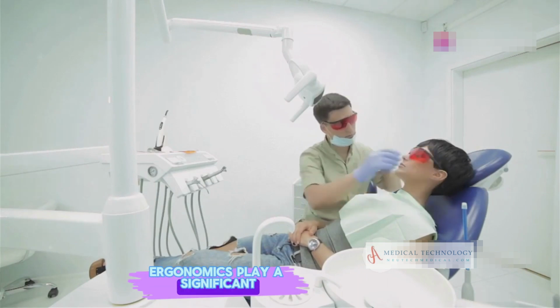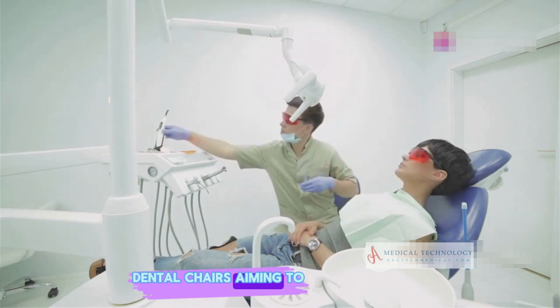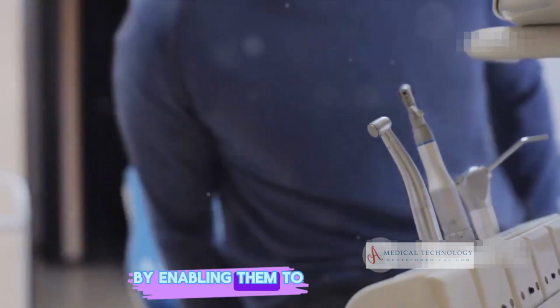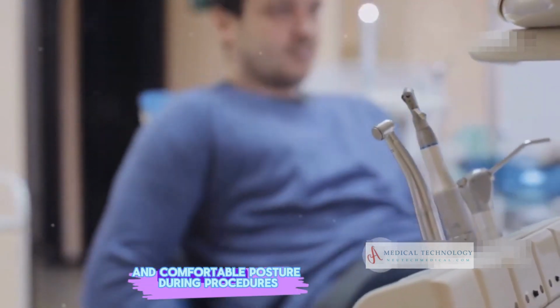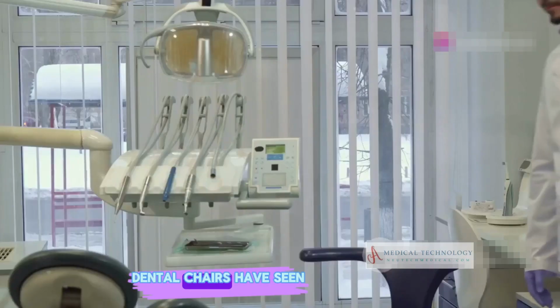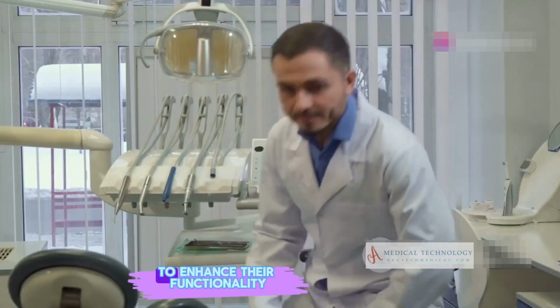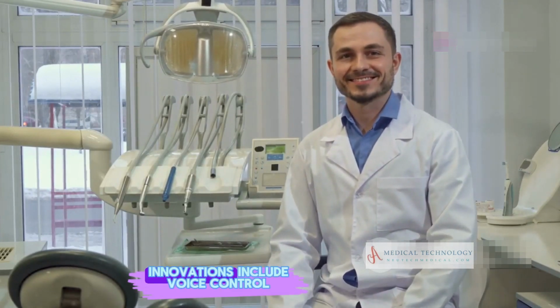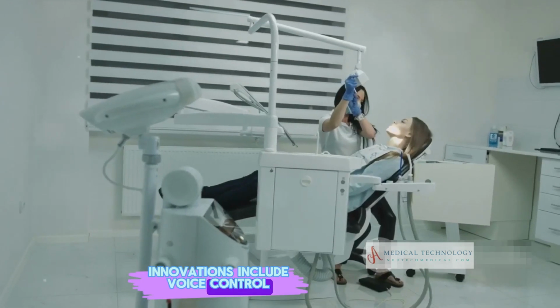Ergonomics play a significant role in the design of dental chairs, aiming to prevent musculoskeletal problems for dentists by enabling them to adopt a more natural and comfortable posture during procedures. In terms of innovations, dental chairs have seen significant advancements to enhance their functionality and integration with technology. Some of the key innovations include voice control.